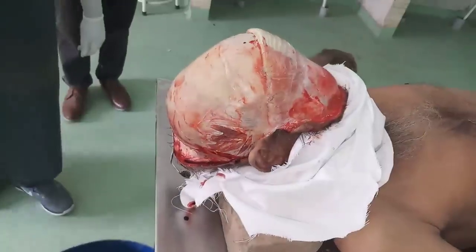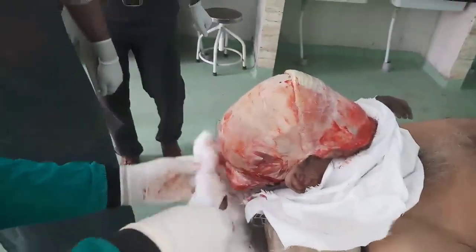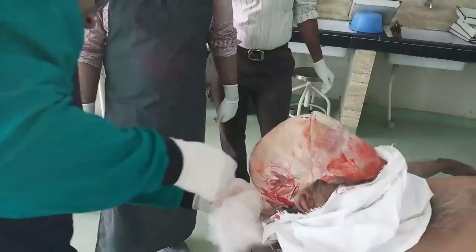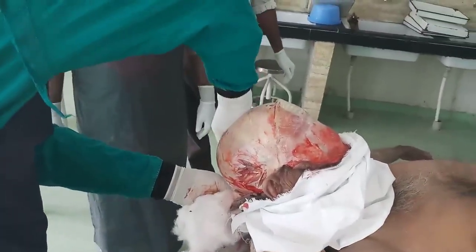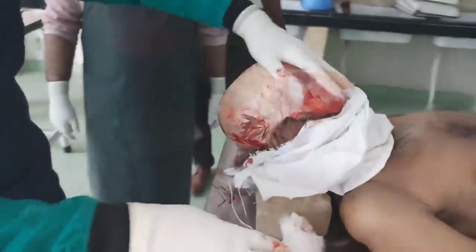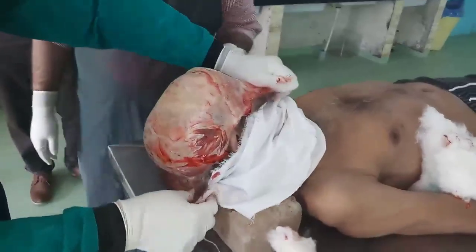See, I am retracting the posterior flap. So see, now the anterior flap is anteriorly and the posterior flap is posteriorly.